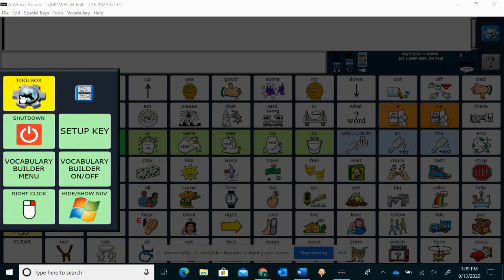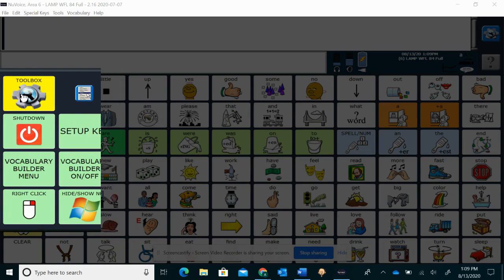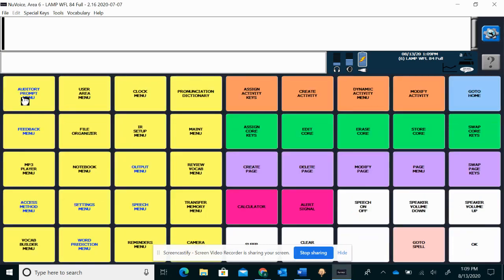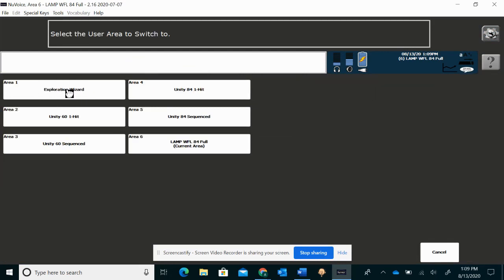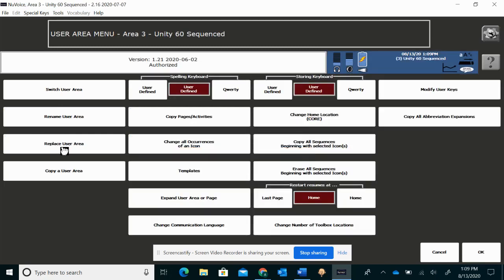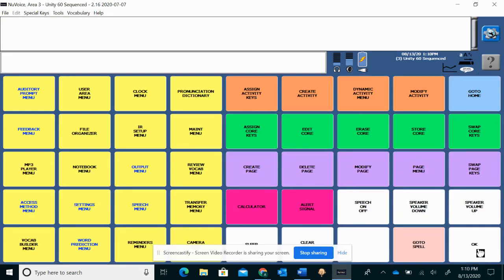So this is how we change the vocabulary file. If you know your student is not using Lamp and you would like to explore something else, you would go under Toolbox, User Area Menu, and Switch User Area. Say you had a user that was using Unity 60 Sequenced. You would click on that. Click OK. Click OK again.